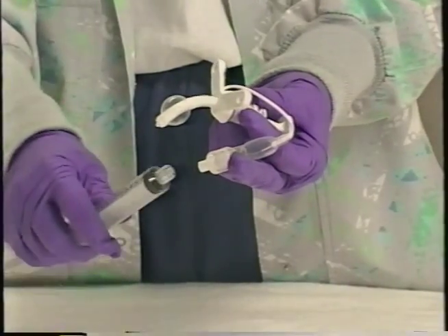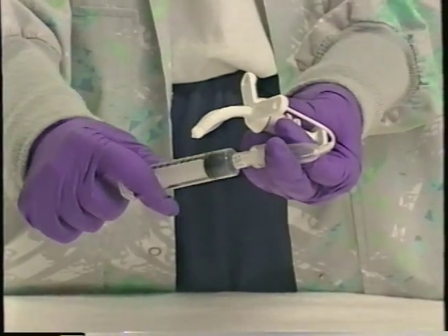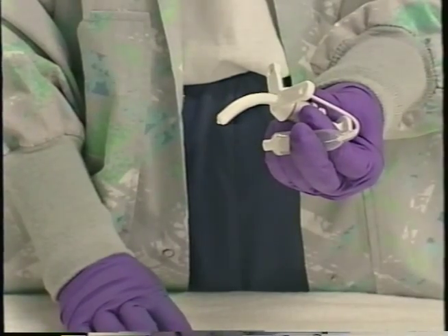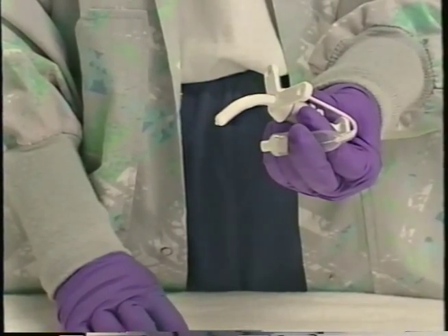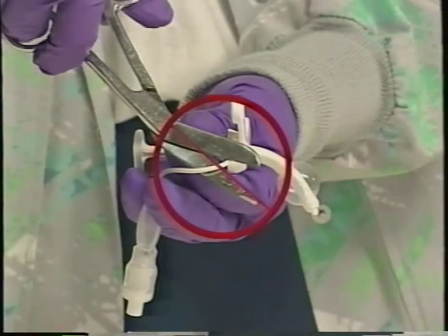When changing a cuffed tracheal tube, deflate the cuff prior to tube removal. Connect a syringe to the valve on the pilot balloon and draw out the air or water until it collapses, reflecting that the cuff has been reliably deflated. Do not cut the balloon, as this does not reliably achieve adequate deflation.